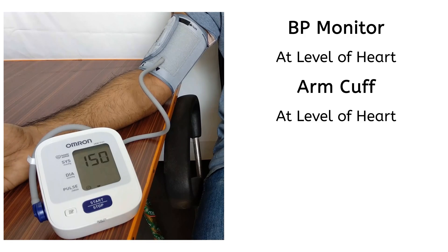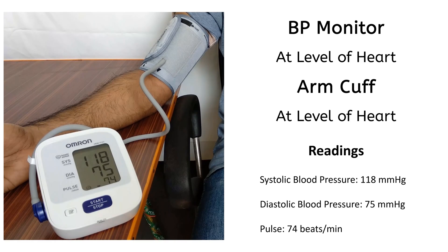We will start our testing with both BP monitor and arm cuff at the level of heart. The test videos have been fast forwarded to see the reading without wasting much time, and as you can see, these are the readings on the monitor.